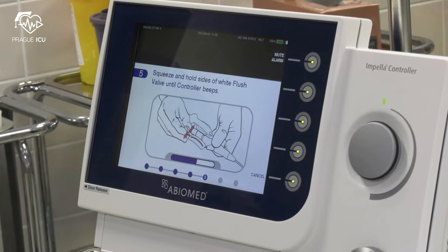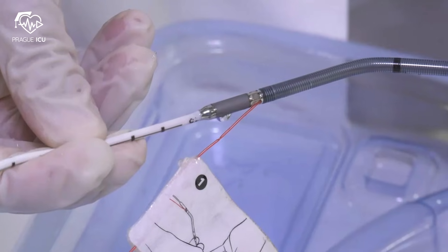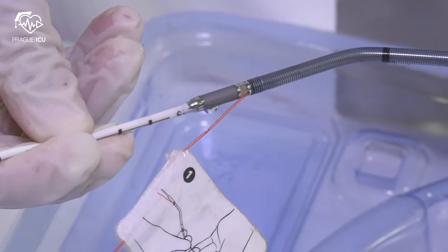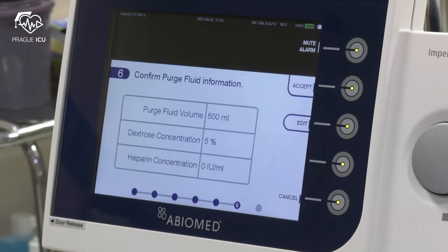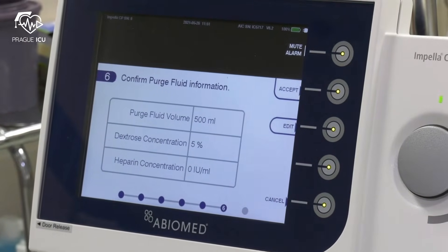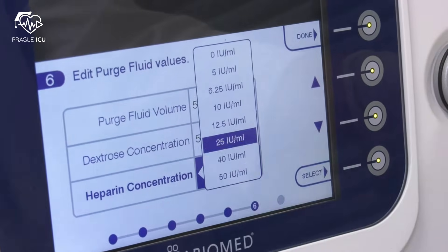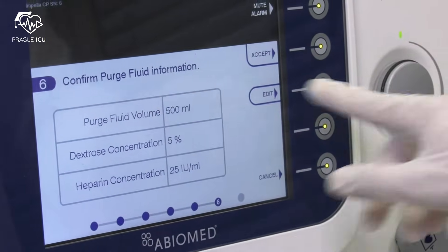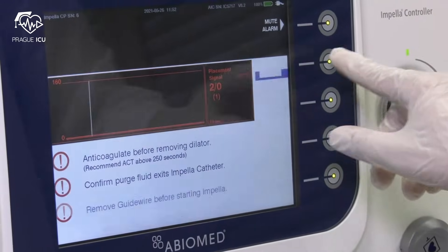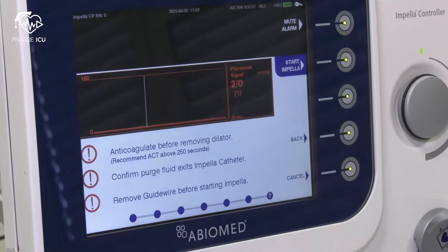Now automatic priming has started. Squeeze the sides of the white flush valve and hold until the automated Impella controller beeps. Check for purge fluid leakage from the open pressure area. The next step will appear automatically — check or correct purge fluid information. We recommend glucose 5% with 25 units of heparin per ml.